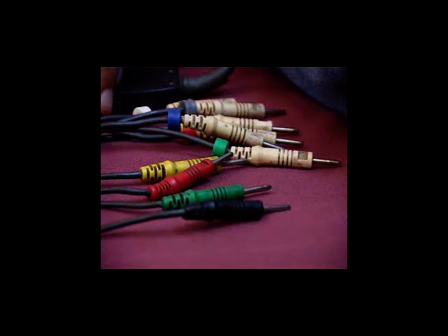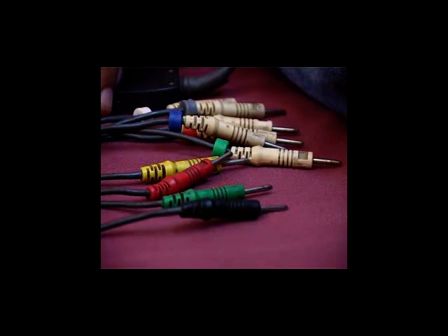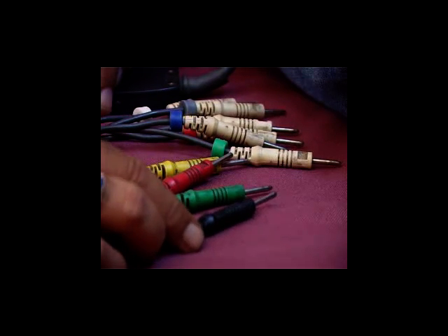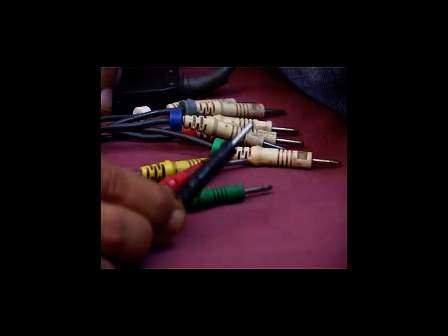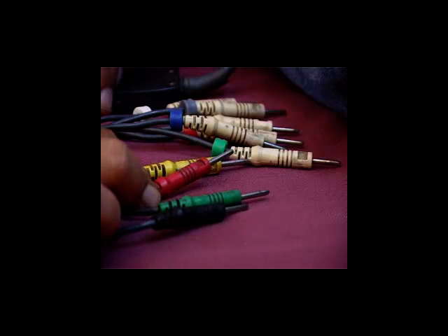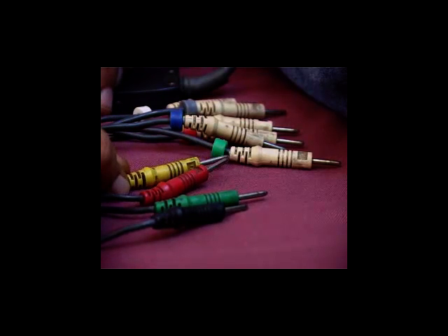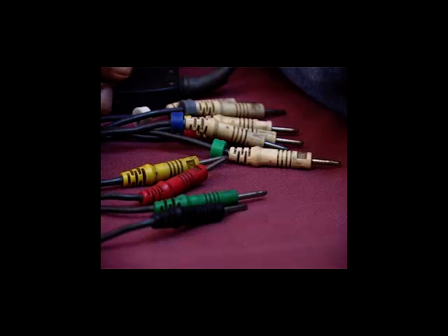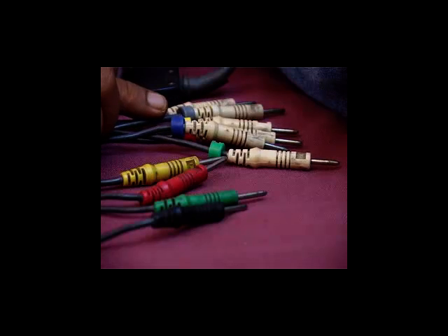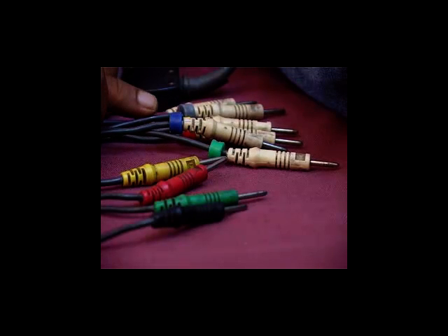The patient cable consists of 10 leads, each lead carrying an electrode at its tip. Accordingly, there are 4 limb electrodes and 6 chest electrodes. Each limb electrode is color-coded and marked. For instance, black for right leg, green for left leg, red for right arm and yellow for left arm. Accordingly, the chest electrodes are also color-coded and marked V1 to V6 for different positions over the precordium.